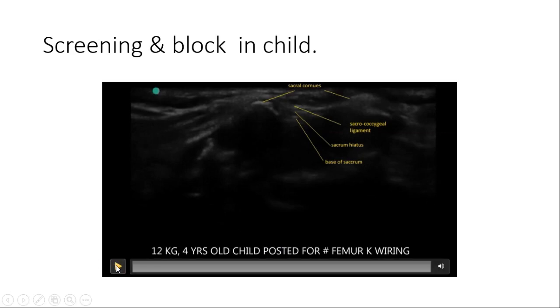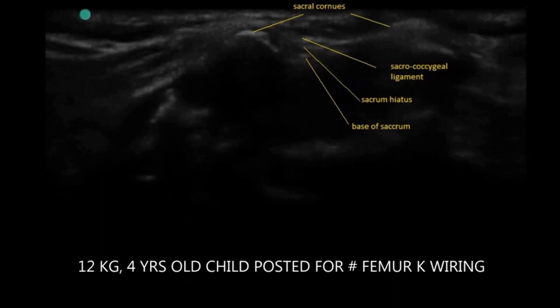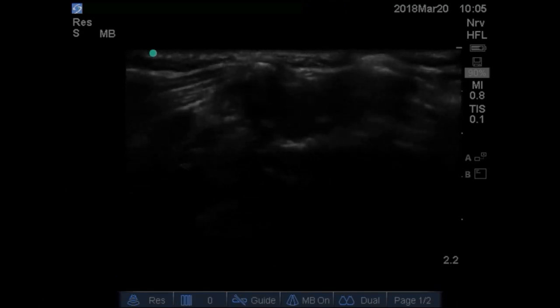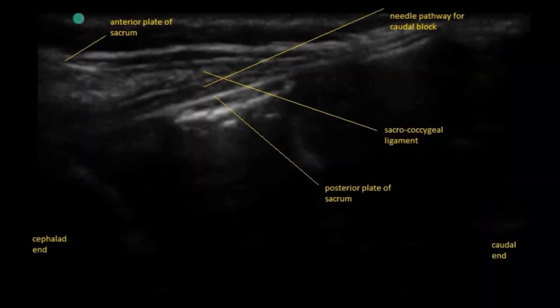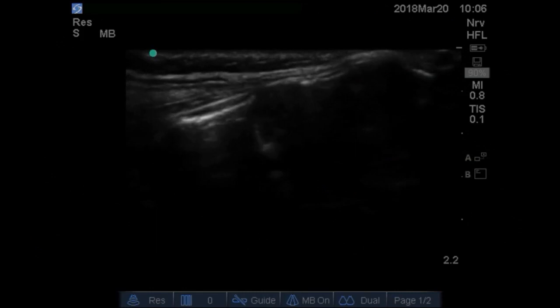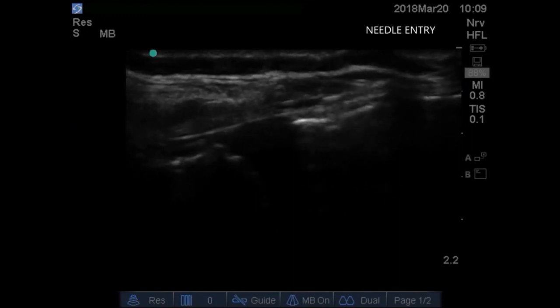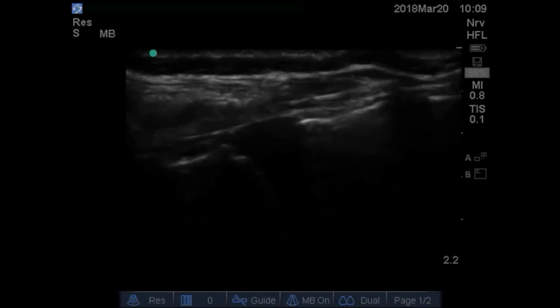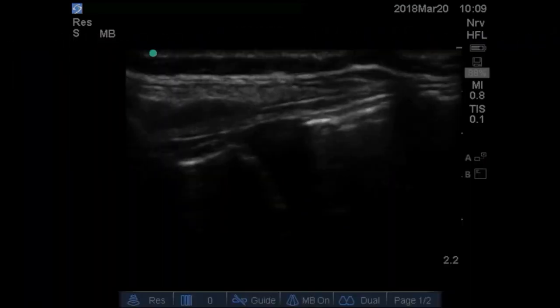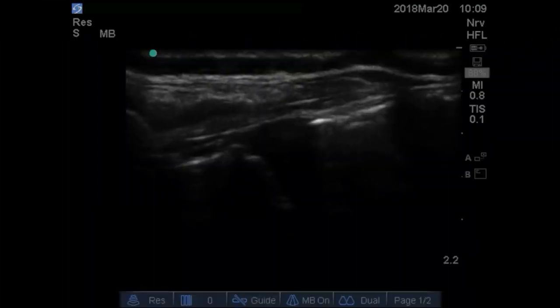Now let's see a block performed in a child. In the horizontal view we identify the two sacral cornua, then convert to the longitudinal view to well visualize the sacrococcygeal membrane and the epidural space. In real time we enter the needle into the caudal epidural space. The needle is very well visualized entering between the sacrococcygeal membrane and the dorsal base of the sacrum. See the drug distribution.